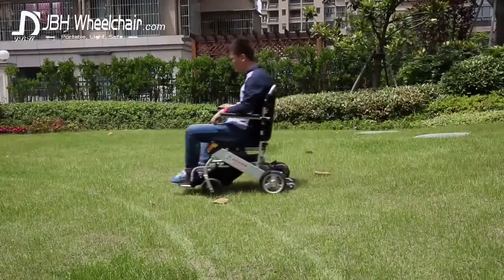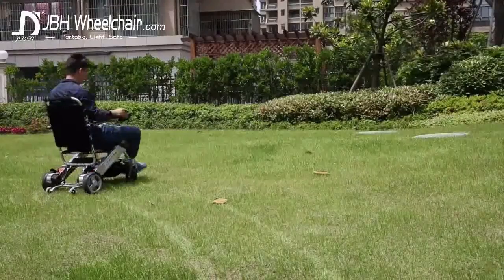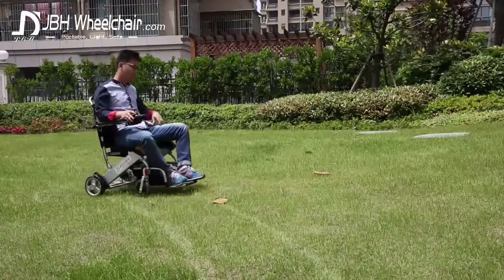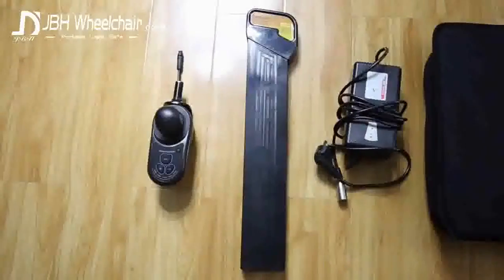This is the JBH-D05 lightweight, folding and totally portable electric wheelchair. Ideal for long distance travel, general home use, getting daily errands done in comfort and ease, or for a spontaneous outing.